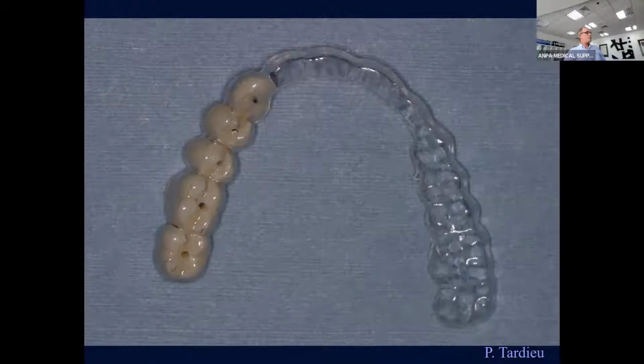With that wax-up, we make a plaster cast, and we fabricate this piece of thermoplastic plastic, which is covering the teeth and placing the teeth in the right position. And then we open. I have opened that since 2000. We make openings instead of placing pieces of metal or titanium or whatever. So we now make openings, and we stabilize that like this.